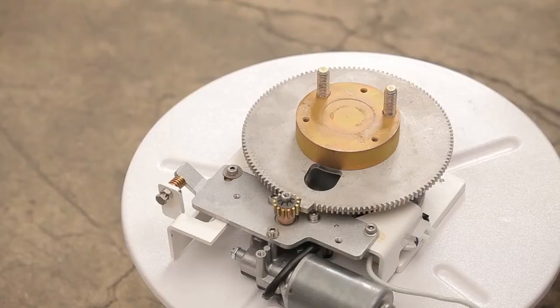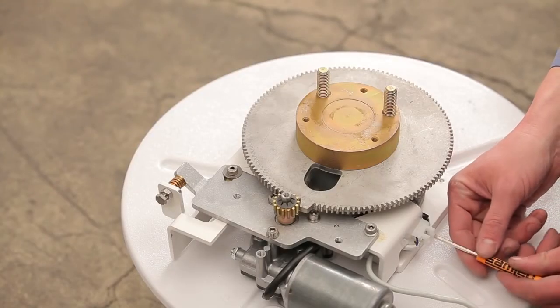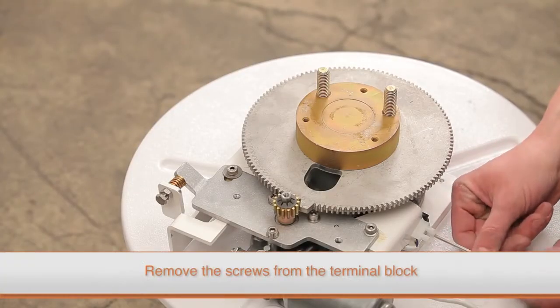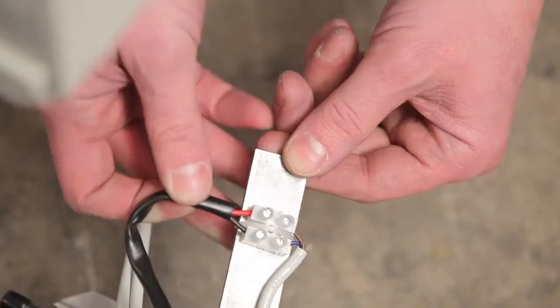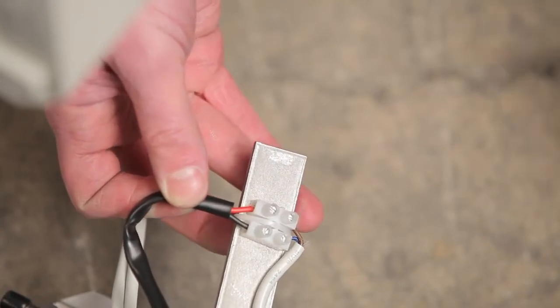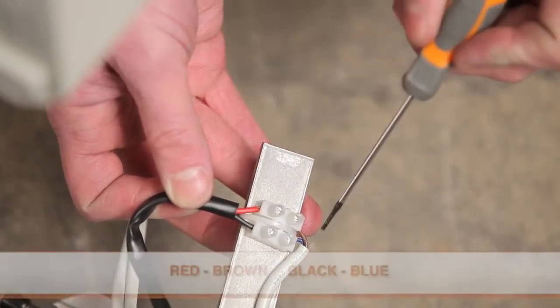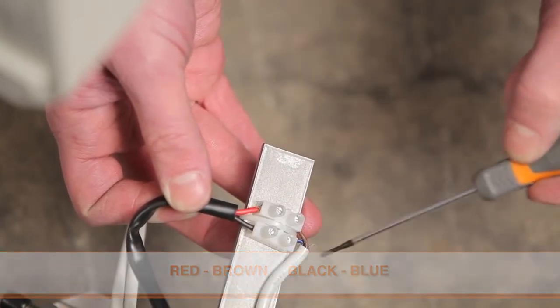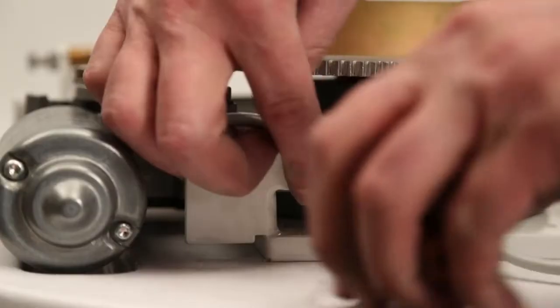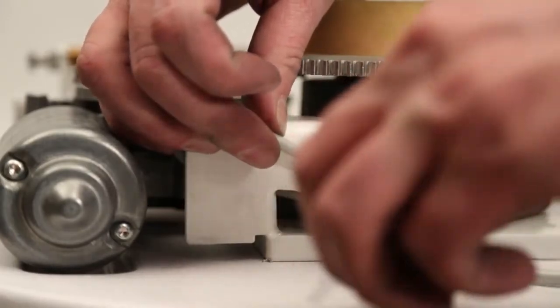To replace the motor cable, loosen the two screws in the terminal block with a small flat blade screwdriver. Then remove the cable end. Connect the end of the cable to the terminal block, making sure that the red wire from the motor is matched to the brown wire from the cable, and the black wire from the motor is matched to the blue wire from the cable. Then securely tighten the terminal screws.